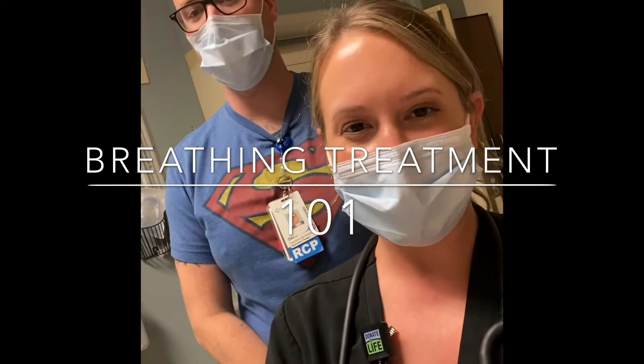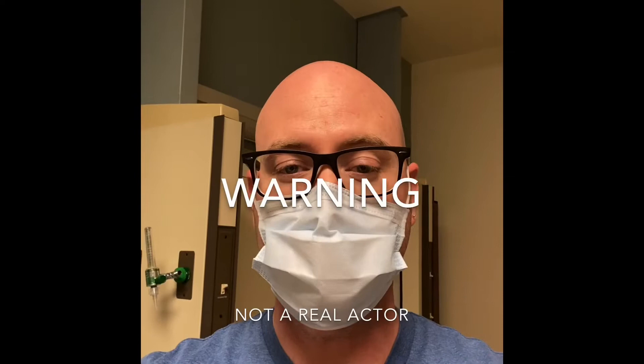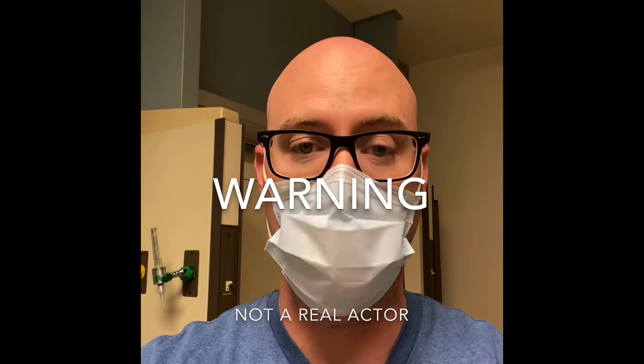Hi everyone, I'm Kara and I'm Dave and we're with Respiratory. We're gonna show you today how to do a breathing treatment. The purpose of this video is to teach you the proper way to give a breathing treatment in the event that the Respiratory Care Services is overwhelmed with other patients.